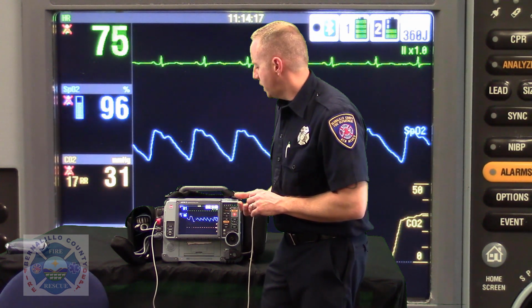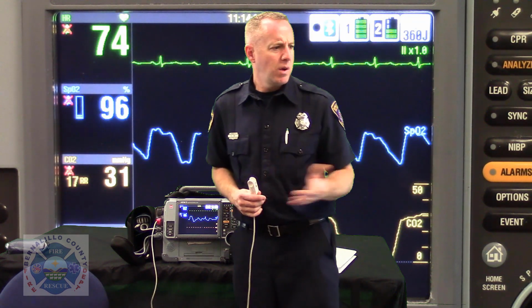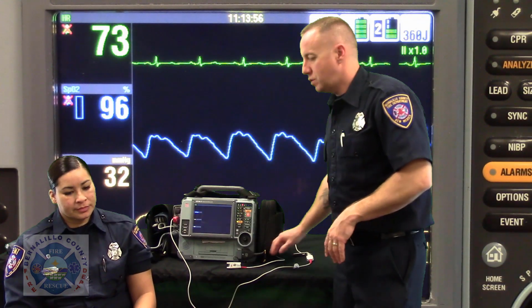So we're going to move on then to non-invasive blood pressure reading. So I don't know if you want to be a patient or not. Yeah.